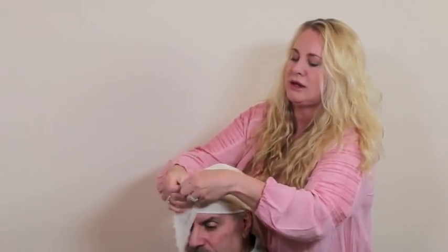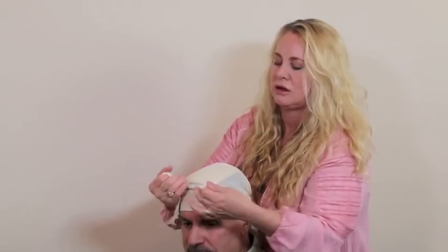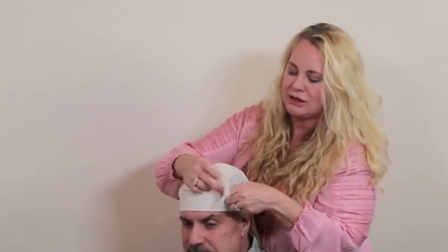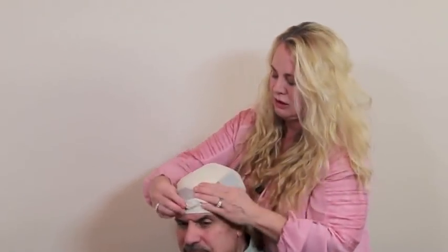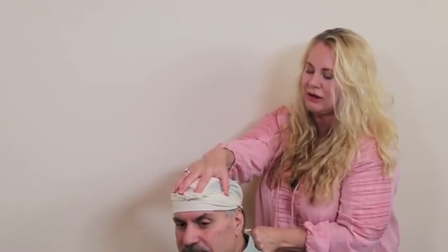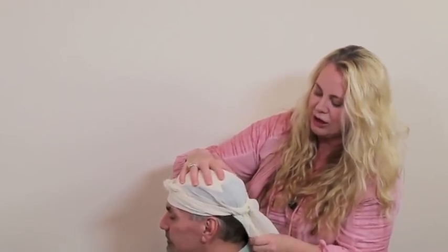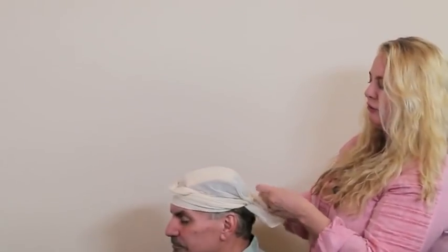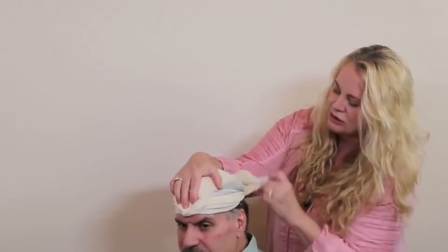Come to the front, remove the patient's hand, make sure the bandage is over the forehead and bring it around twice so it slips easier, then once more. Tuck the ends into the fold so they don't hang down on the patient's face. In the back, give the excess piece a little pull — that tightens around the gauze on top of the head. Fold and tuck that piece into the edges so it's not hanging down. That is a wound dressing on the head.